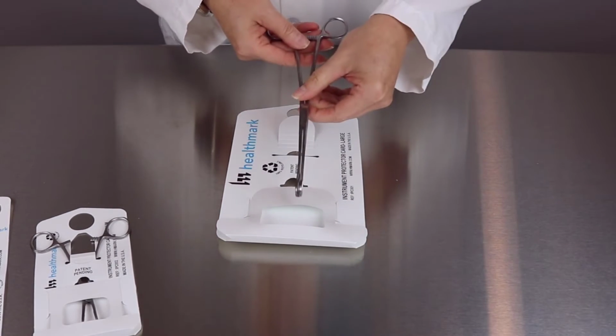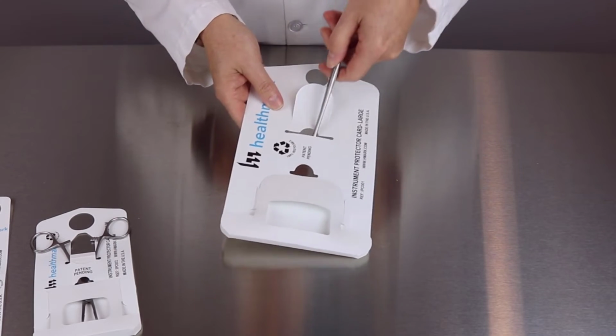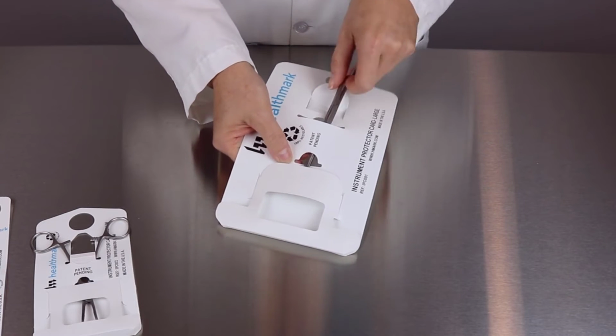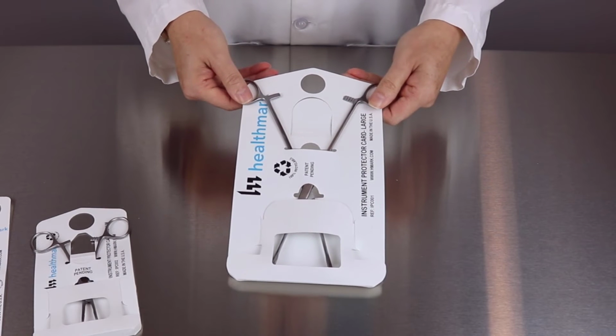Next, you're going to take your instrument and slide it through the larger slot. You're going to feed it back through the card and then through the small slit and then down into the pocket of the card. You're going to extend the arms of the instrument open.